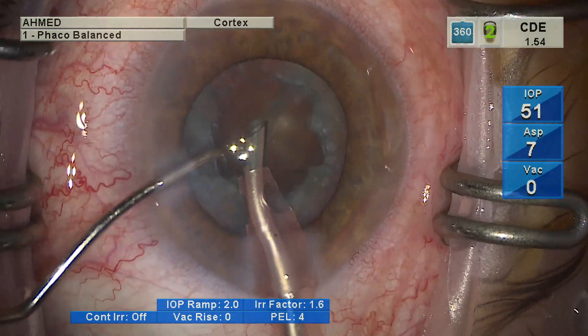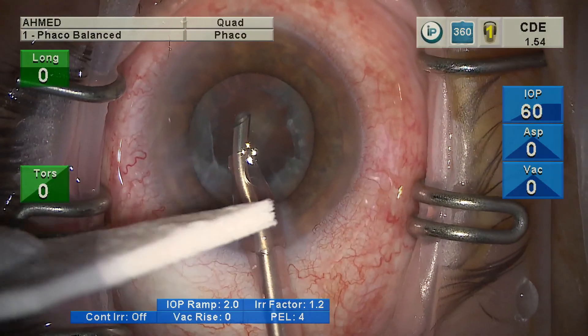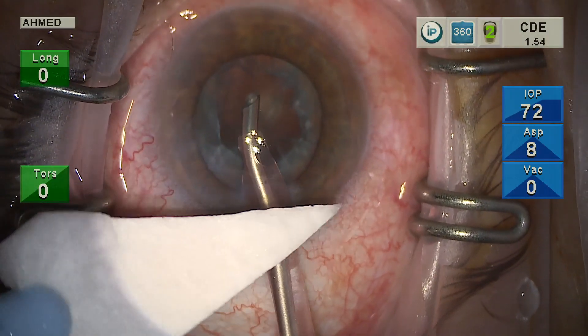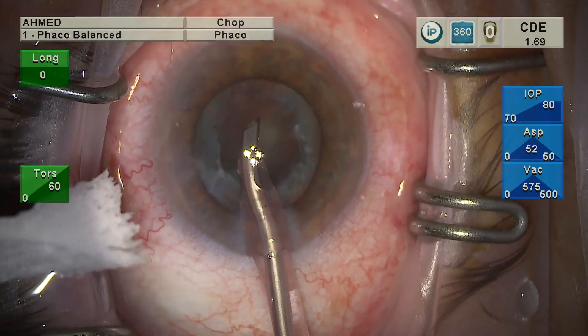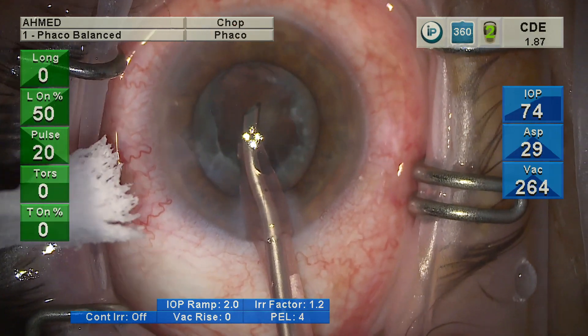One may argue of course that there may not be visibility of the aerosol in the microscope view here. However, one would expect to see some wetting on the surface of the silicone sleeve and the beading, as we have seen on previous videos done in an in vitro design with cadaveric eyes.